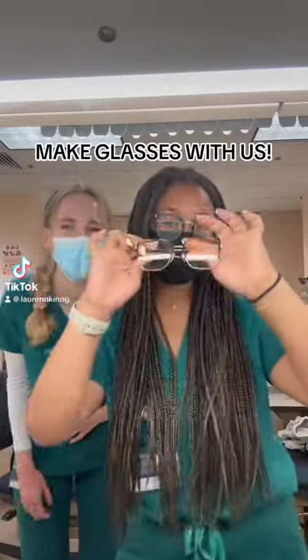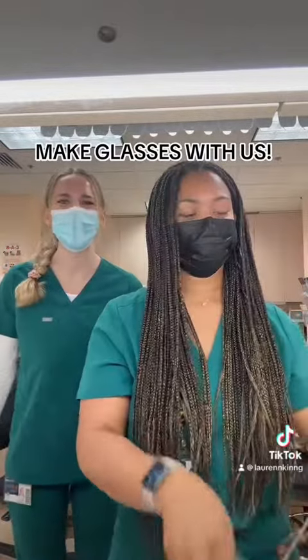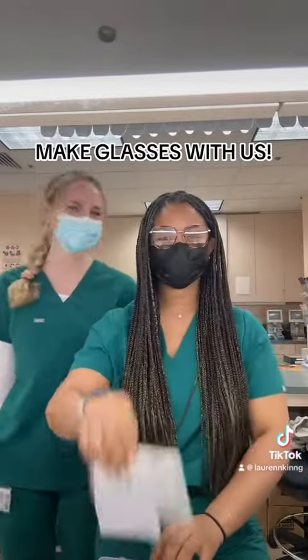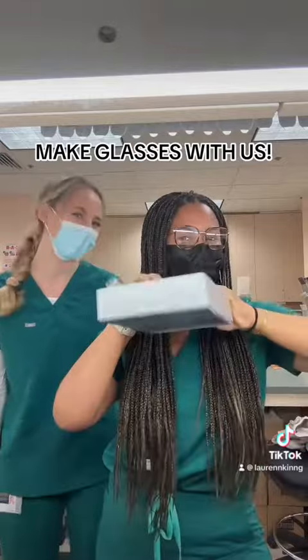Hey guys! Jordan and I over the summer have the great opportunity to spend our time in the lab making glasses for the patients in Berkeley Optometry. Today we're making my frames, so come along and see how it goes.